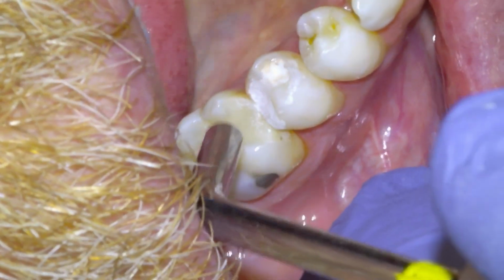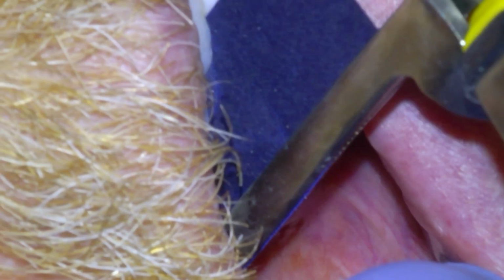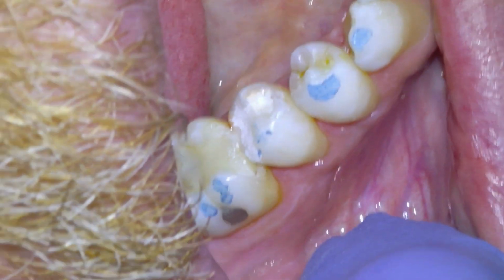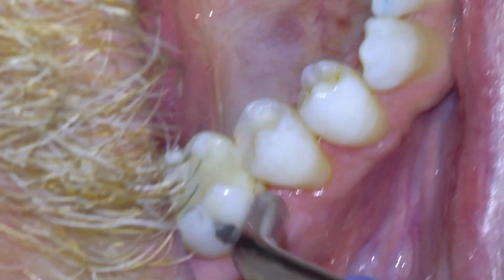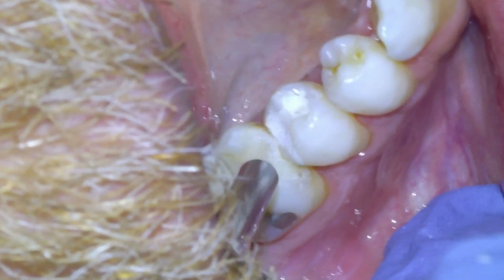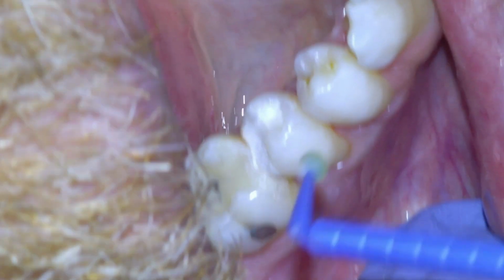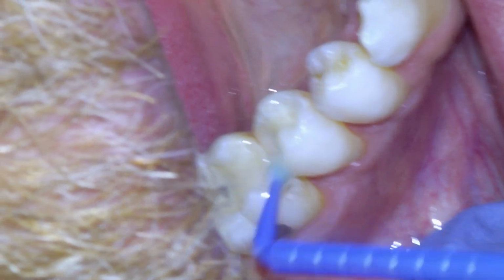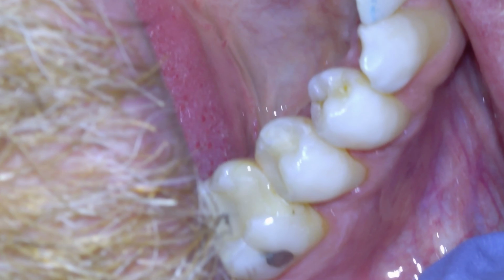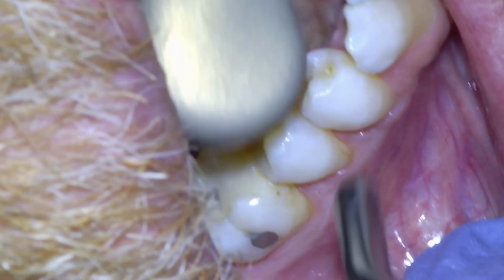I'll dry the material because it marks better with the bite paper. Have the patient bite down and grind hard, and I typically aim for no contact on my direct restorations. We'll wipe off the ink, dry the material, and then apply our varnish agent, Aqua Coat. That's going to get painted on. I'll usually air thin it. Gets light cured, and then that's pretty much good to go.